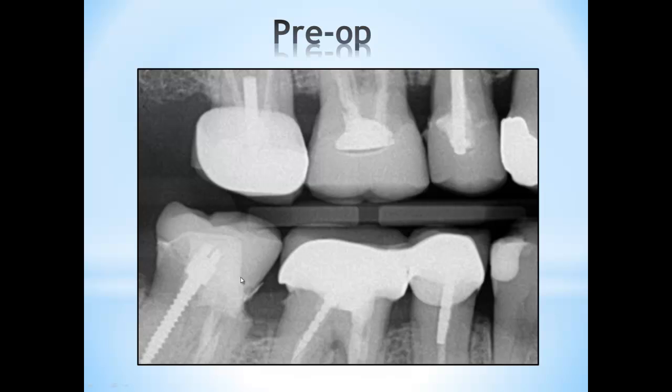So the patient came back for a bite-wing. You can see that my margin is way off from where it's supposed to be, but there is no cavity. The patient is not complaining. I understand that the root canal was done. But look at this x-ray, I said I have to redo my crown because it's not perfectly fitting. I offered to redo this crown free of charge, because it's not a standard of care.